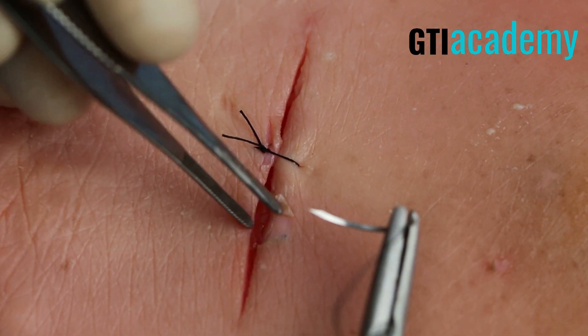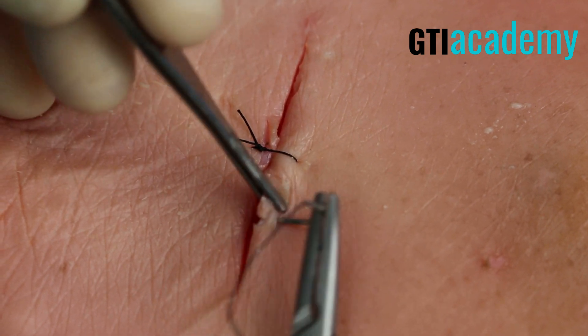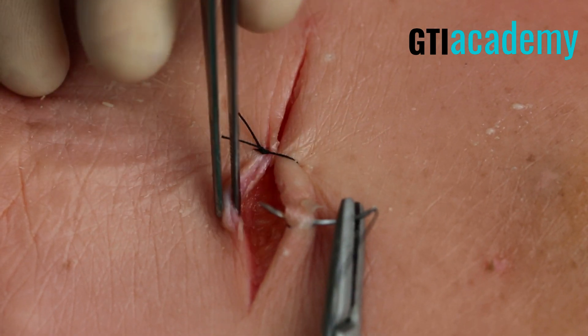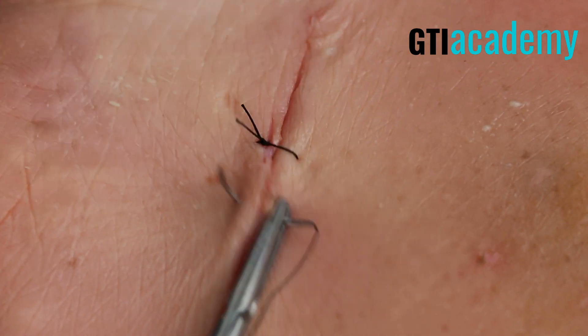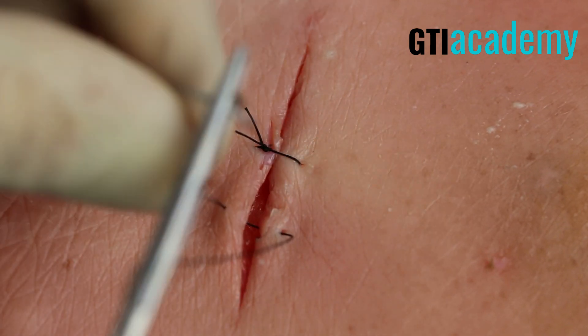Now look at the middle of the wound. Measure the distance to the end and we're going to put one right in the middle. This allows equal distance in between each suture.